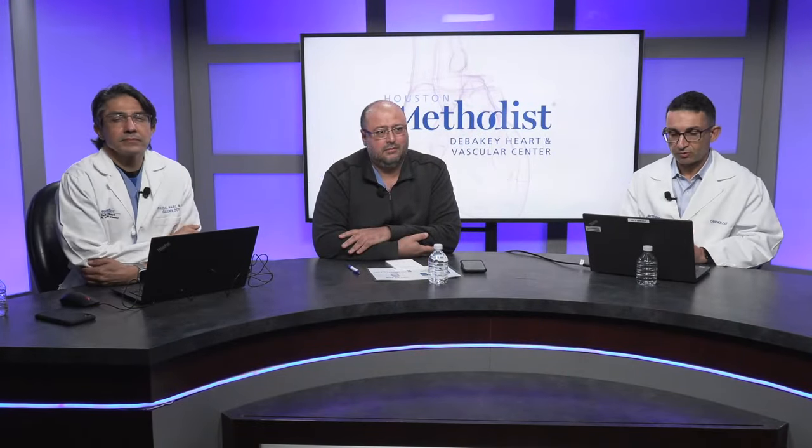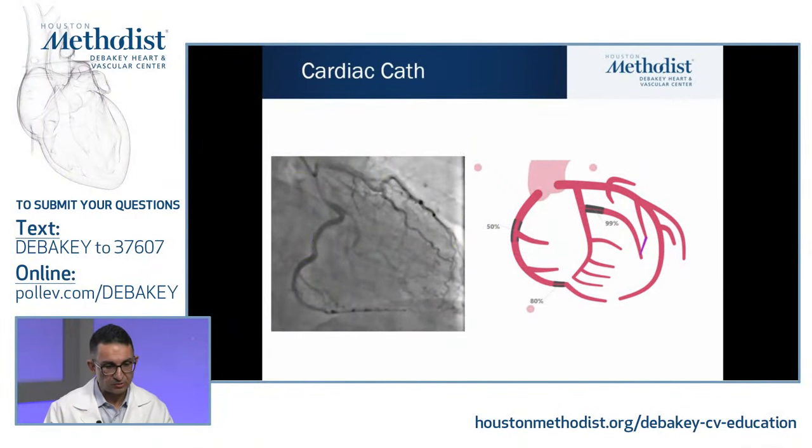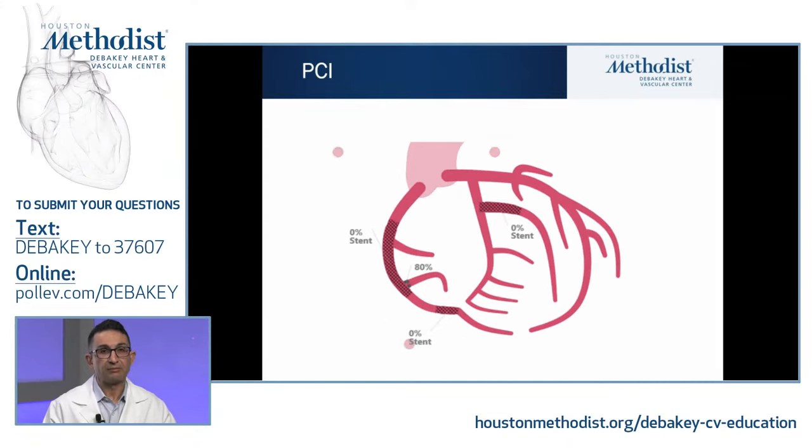Yeah, exactly. So this patient underwent a coronary angiogram, and the coronary angiogram clearly demonstrated a 99% lesion in the first obtuse marginal, with some collateral flow that was coming from the LAD. There was a distal lesion also in the RCA, and the patient underwent IVUS guided PCI, and the OM lesion got stented. There were some complications initially when they were trying to do the wire in the RCA, and they had to also do a PCI to the RCA as well in this case.